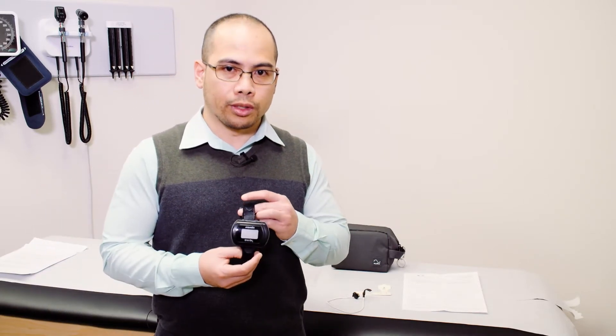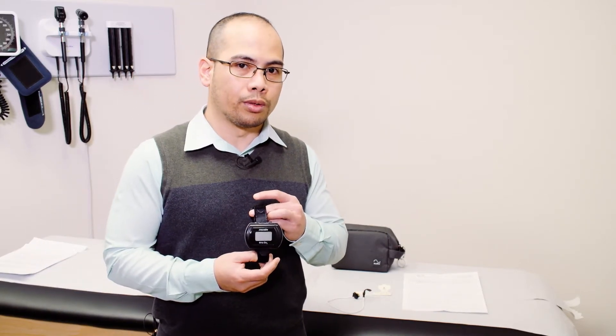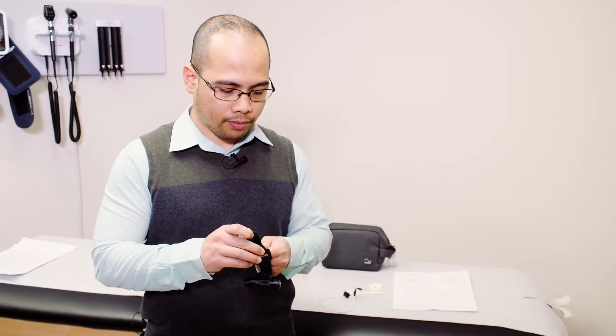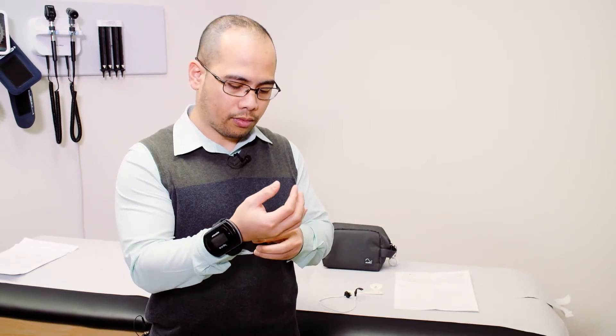Let me walk you through it. This is a straightforward sleep study. In this particular test, there is one main recorder that needs to be worn around you or your child's wrist. It comes with a Velcro attachment that you can easily adjust for the right fit. It is worn around your wrist like so. It doesn't need to be tight as long as it stays in place.